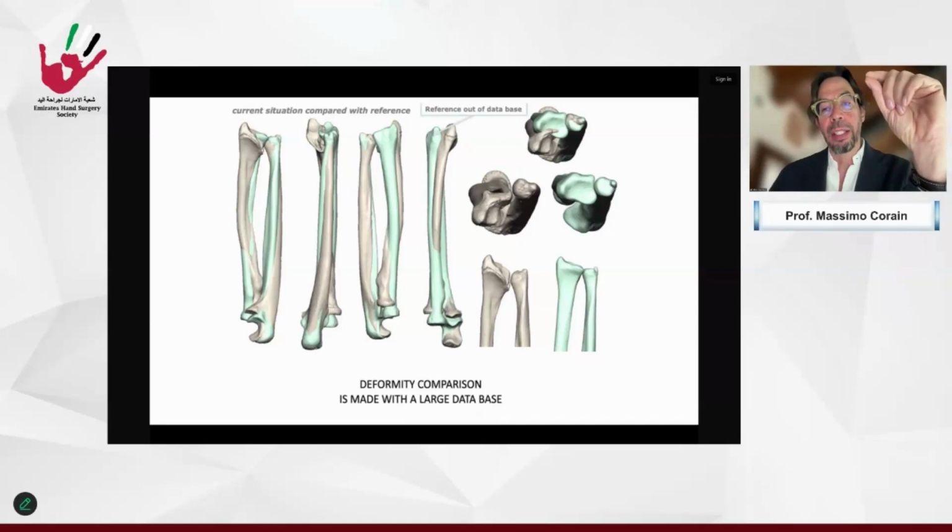So in this case, I don't need to create a forearm like a healthy one, but I need to realign it, to give support to lunate, and avoid impingement of distal ulna, because in this case, I could disturb the pronosupination. So I can simulate. Obviously, it is the congenital deformity.